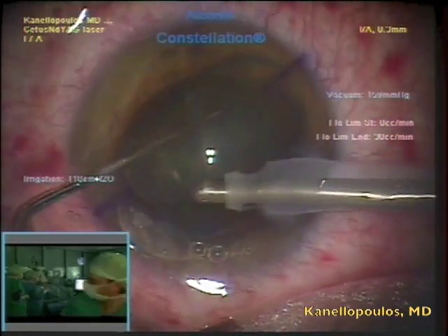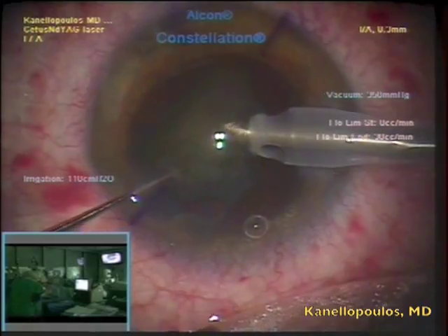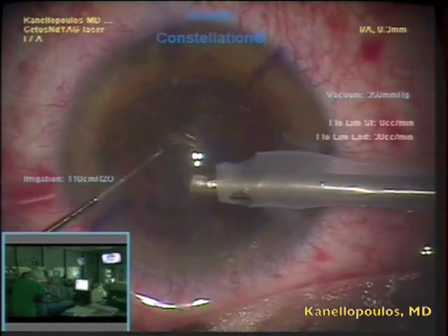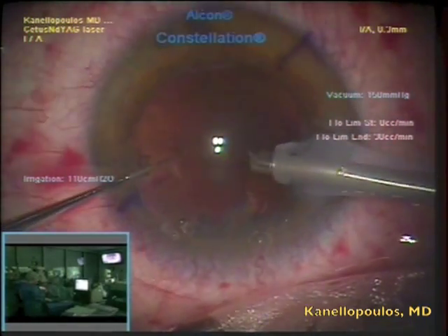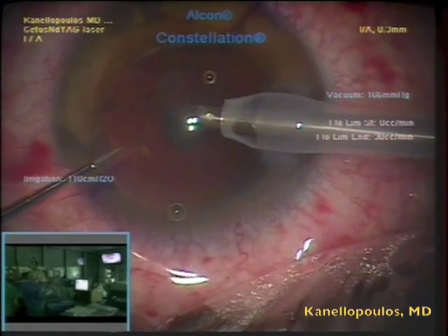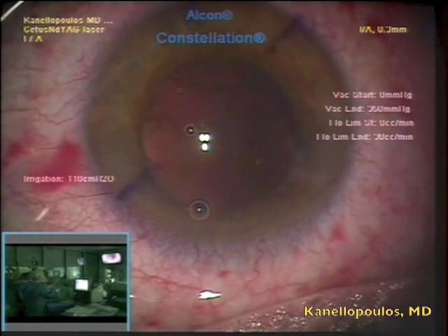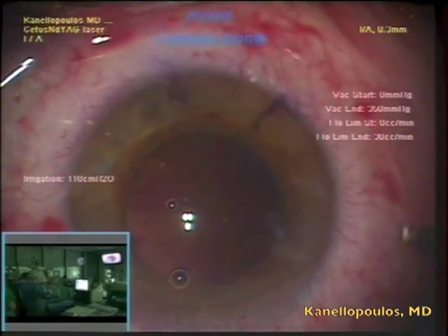I'm continuing here my emulsification and disassembly of the lens. The two last quadrants come as one piece, and I will very easily emulsify those as the lens is being shot by the nanosecond laser. You can see the small jerk actions that this laser performs — it jolts the lens, emulsifies it enough to absorb the fragmented pieces. I'm picking up the last fragments, careful not to incite movement of the posterior capsule. The actual cataract part of the procedure took 1.2 minutes. The femtosecond laser part of the procedure took 1.5 minutes.